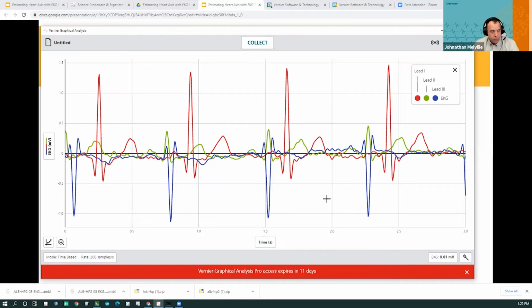And what's great is if you want other data, Sarah and I have put our data, actually, don't tell anybody it's our data, but it is our data, in the example data. So if you were to buy the Human Physiology book, or there is sample data provided in our sample data library, there are 2 versions of sample data. There's sample data that shows it being different, so you can actually see from subject 1 to subject 2 there is a difference in heart axis. And I can even show you how to open that data and take a look at it. We can share this data really quick if you would like.